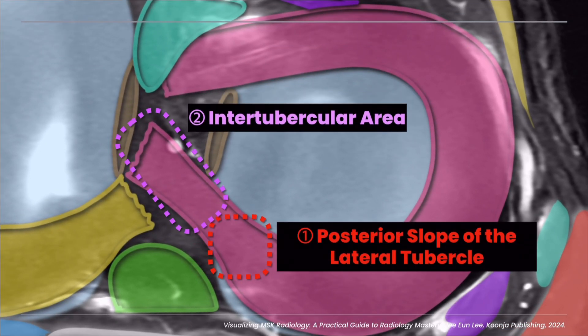The first attachment is on the posterior slope of the lateral tibial tubercle, which corresponds to the minor component of the lateral meniscus posterior root. The second is at the medial tibial tubercle, along the intertubercular crest, just posteromedial to the anterior cruciate ligament tibial insertion and anterior to the posterior cruciate ligament. This is the major component, and it extends all the way to the posterior aspect of the ACL tibial attachment.